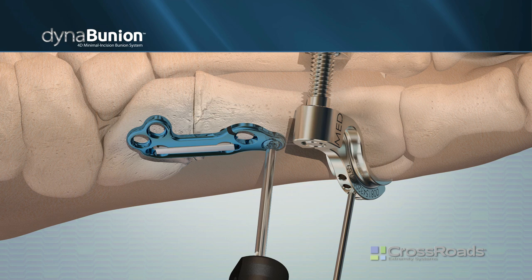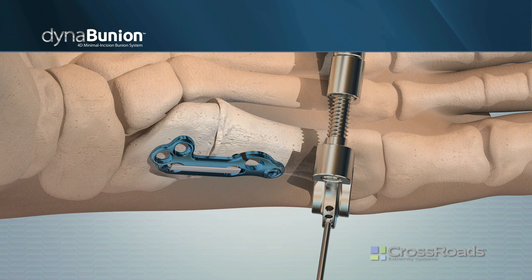Once the screw is placed, toggle the driver side to side to remove it from the screw. Follow the same screw preparation steps to place two additional screws into the remaining proximal holes.